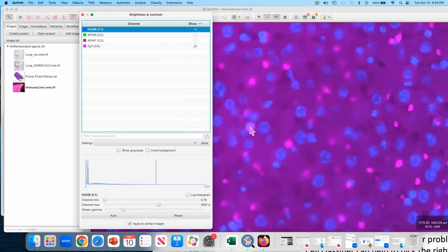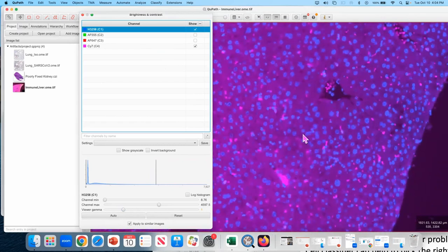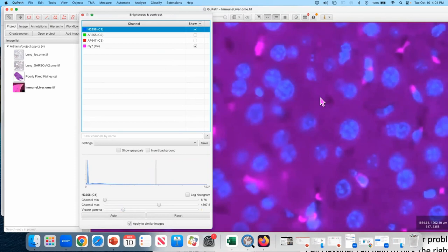So that's a T cell right here, but there are a bunch of erythrocytes, and there are other artifacts that are very prominently visible in this, including some regions that are out of focus. They're not related to the sample quality itself, but to the fact that the slide was tilted in the scanner.